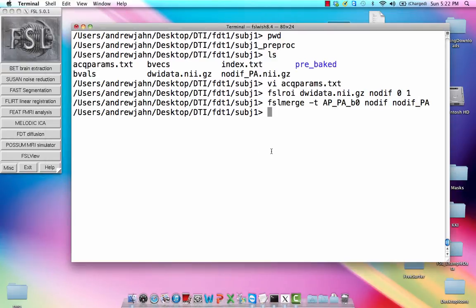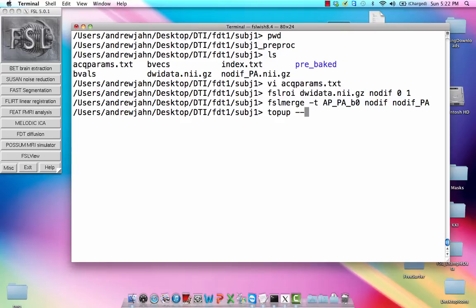So now that we've merged both of those into a single data set, we have what we need to run the top-up to give us some estimates of where all these distortions occur. So this first command, top-up, is just the estimation. There's also apply top-up, which is another command which will actually apply it and try to unwarp it.